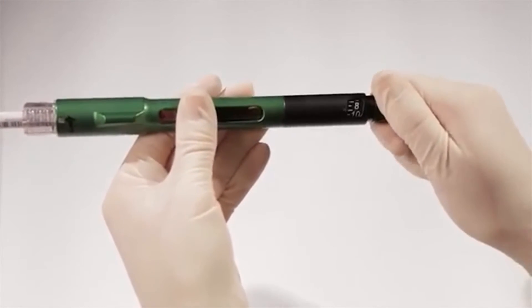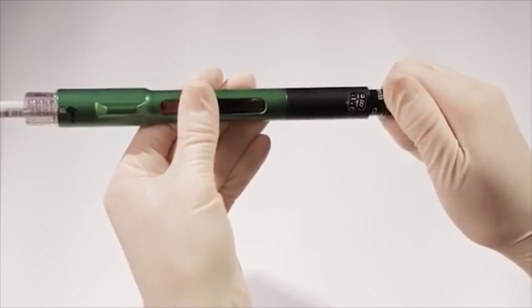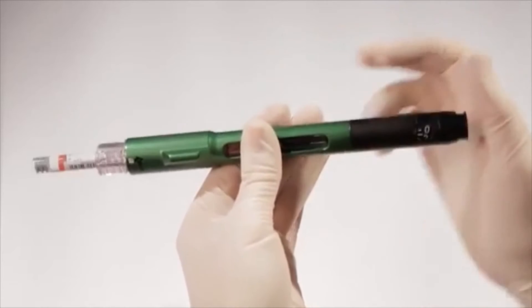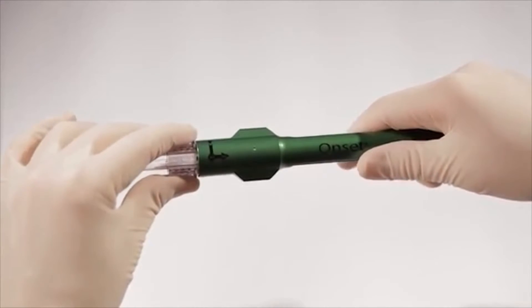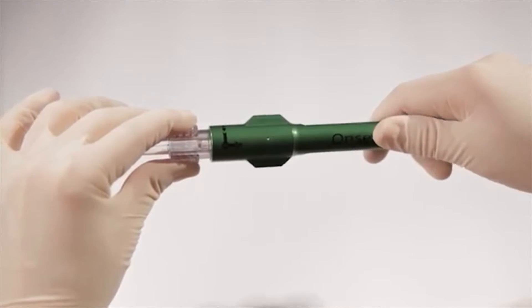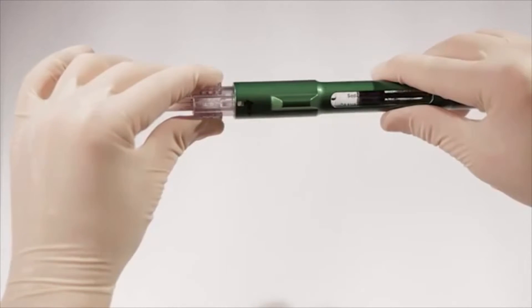Step 2: dial the desired amount of solution to be mixed with the 1.8-milliliter cartridge and push the dispensing button. Step 3: after mixing, remove the 1.8-milliliter cartridge by grasping the connector with your thumb and forefinger. Pull the connector out to the number two position, then turn counter-clockwise approximately one quarter turn to the number one position.